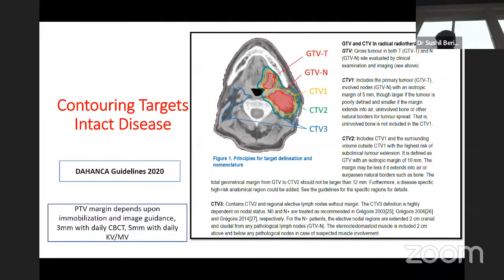Now, not necessarily people follow that. Some people still treat the entire organ in CTV2, others do CTV2 as the GTV plus 10 to 12 millimeter margin. So you need to understand it's not sacrosanct, but there are ways people define it differently. If you do a 10 or 12 millimeter margin following the anatomical landmarks, then you have less volume to treat and you may have less morbidity. But that being said, if you're not sure about it, some people still treat the entire organ in their CTV2 volume.